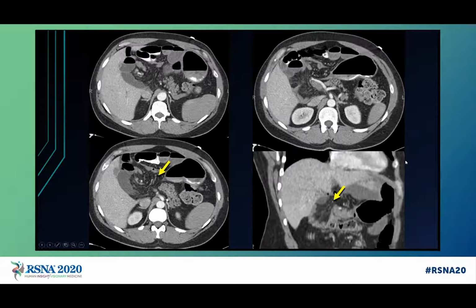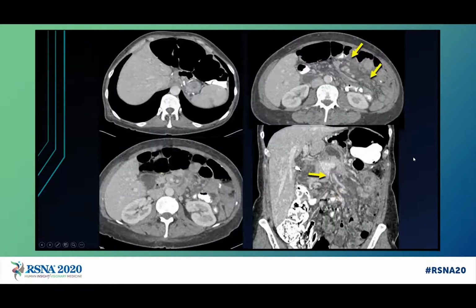It's much more common for us to see internal hernias in patients who have postoperative anatomy like this. This is a patient who's had a Roux-en-Y gastric bypass, coming to our emergency department with abdominal pain. Notice that the small bowel appears edematous. There's an abnormal appearance to the mesenteric vessels, with vessels coursing behind the root of the small bowel mesentery. And if you look at this coronal image, there's abrupt cutoff of the SMV. All these are signs that the small bowel mesentery is abnormally oriented, it is twisted, and placing this patient at risk for mechanical small bowel obstruction, but also ischemia.